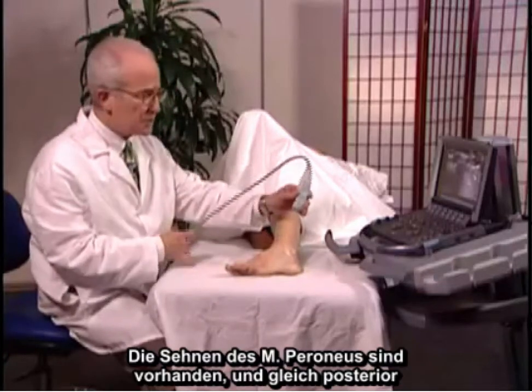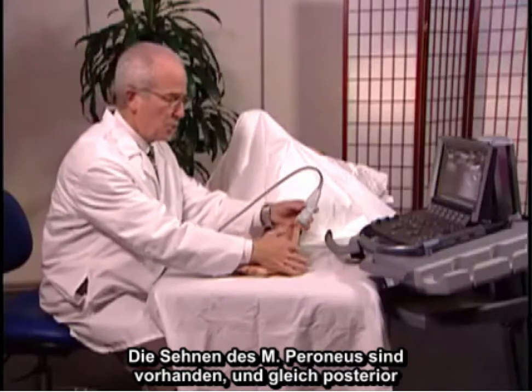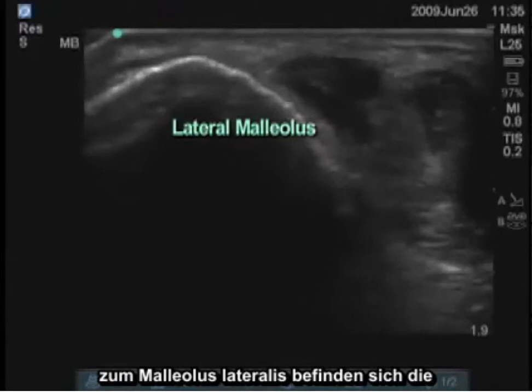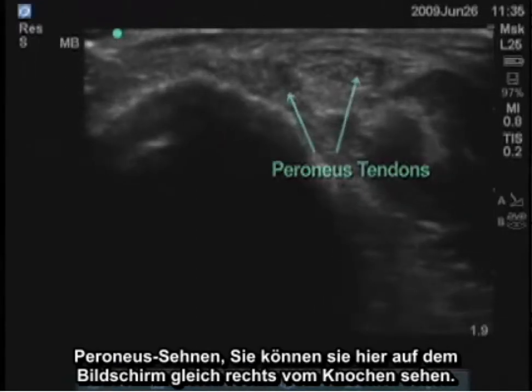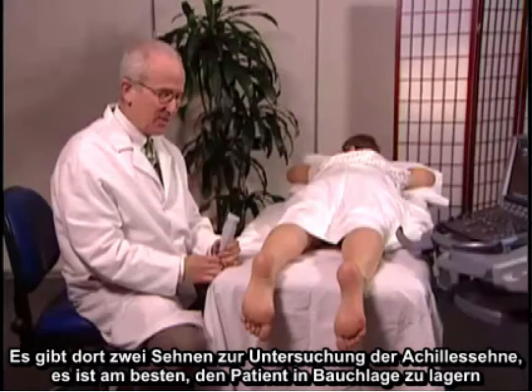We can also look at the lateral aspect of the ankle. The peroneus tendons are present here, just posterior to the lateral malleolus. You can see them on the screen just to the right of the bone — there are two tendons there for examination.